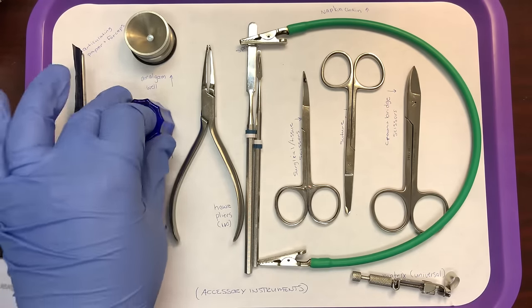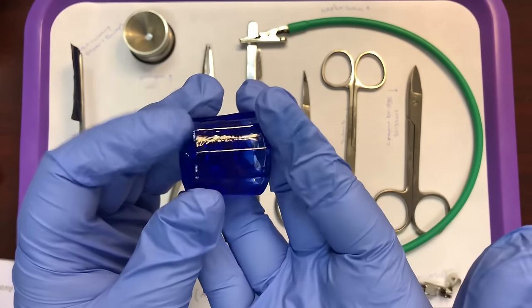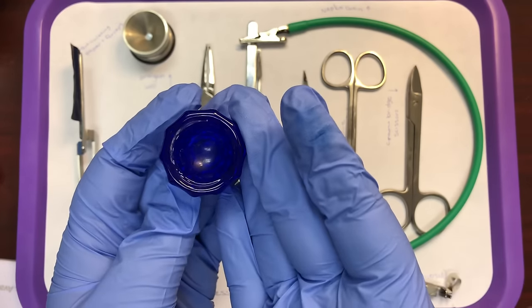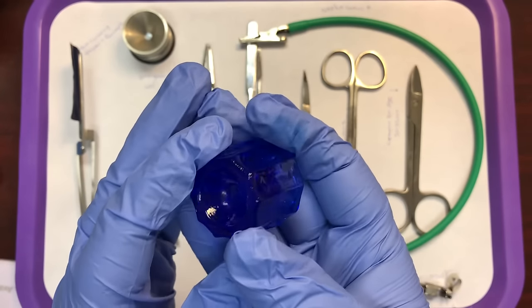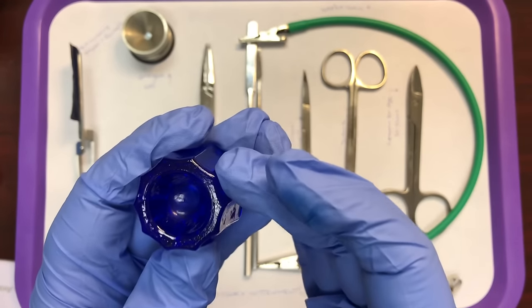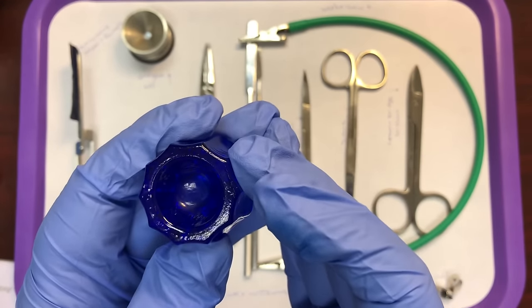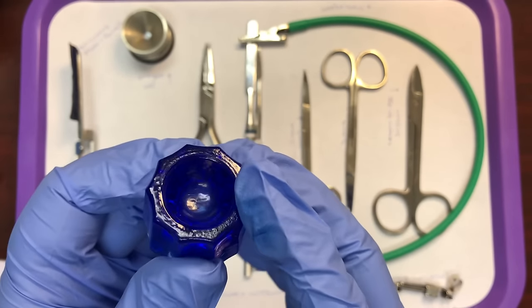Then we have a dappen dish. Dappen dishes hold liquids or powders — any small amount of material. Don't memorize them based on color; they could come in any color — clear, blue, green, red. Dappen dishes are used to hold small amounts of material, liquids or powders.